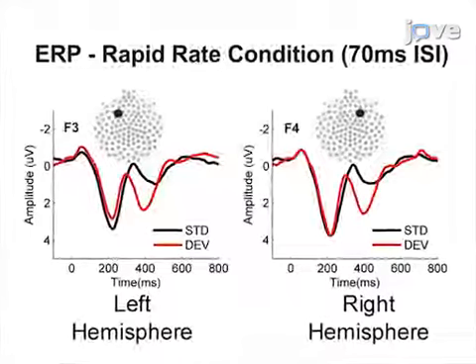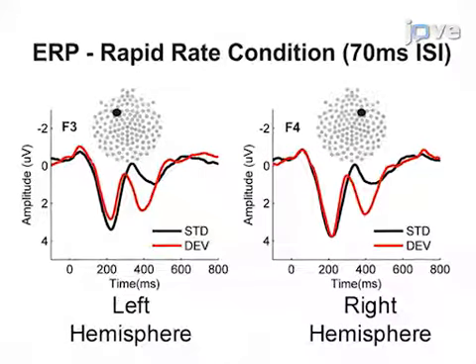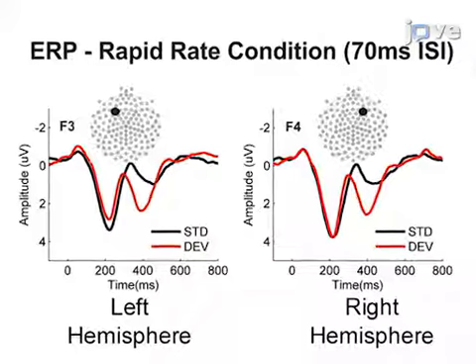Ultimately, analysis of infant brain oscillations is used to show changes in brain function in early development. The main advantage of this technique over conventional ERP analysis is that it allows examination of brain oscillations with distinct parameters of frequency, occurrence, amplitude, and time span.